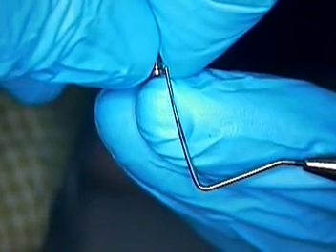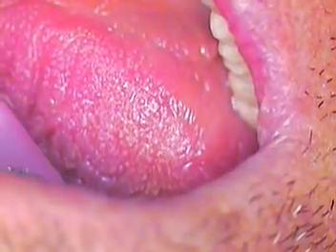If we take the screw and measure this head of the screw, it's less than that, so the prep is well into the screw head itself. So we just need to go laterally. It should be good to go.